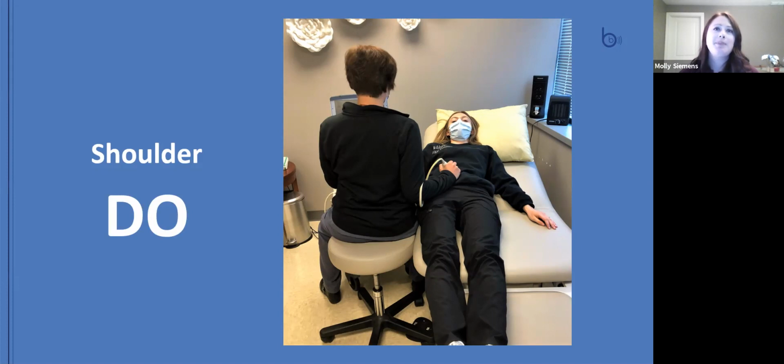Your scanning arm is not the only shoulder that can become injured, though. We also want to make sure that our machine is adjusted appropriately, too. The console should be at a height that doesn't make us raise our non-scanning arm too high. The biggest obstacle to this is when performing venous reflux studies, and one has to reach up to annotate or freeze an image while scanning the patient's lower legs.